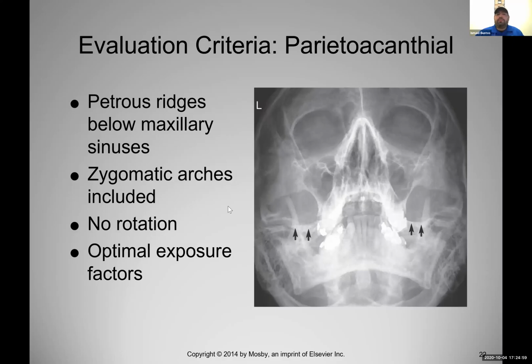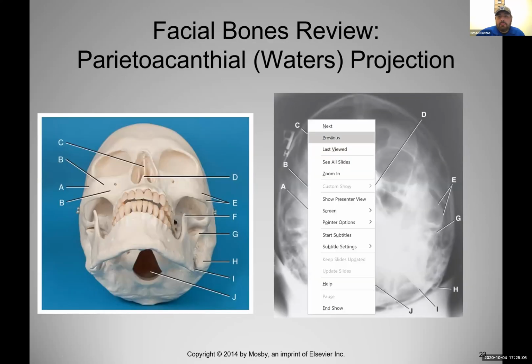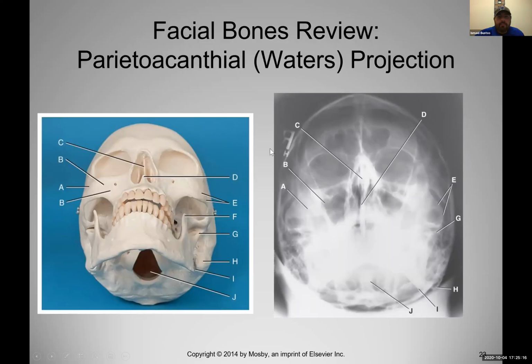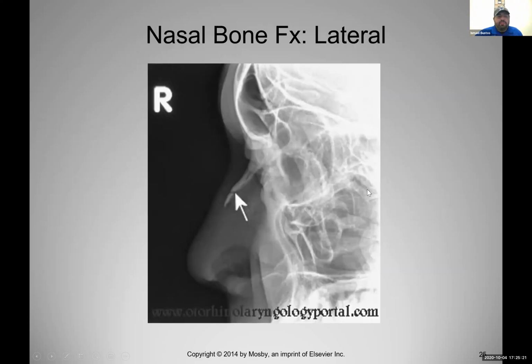All right, and then of course, no rotation. We check from there to there, from there to there, right? Those distances there, make sure there's no rotation. Also no motion, optimal exposure factors, okay? Here's a review we went over last time with all the stuff. All right, so let's look at some radiographs of these two.